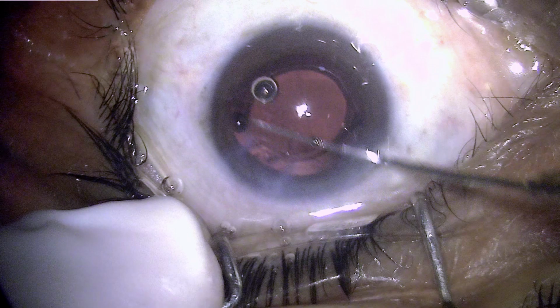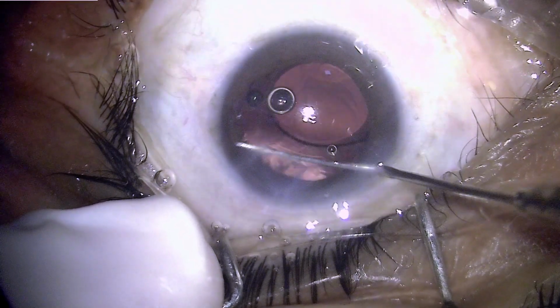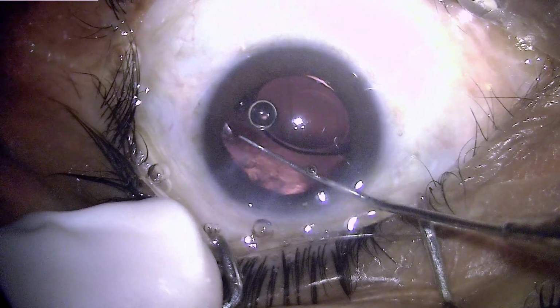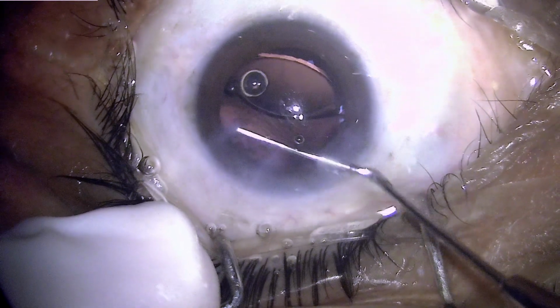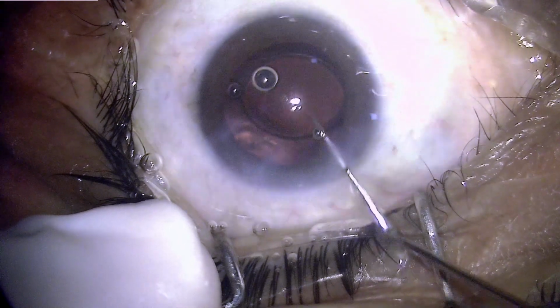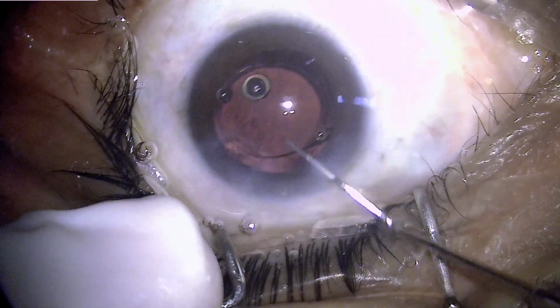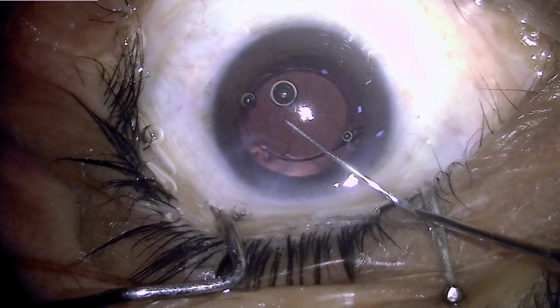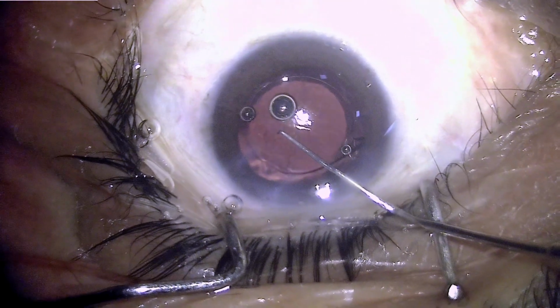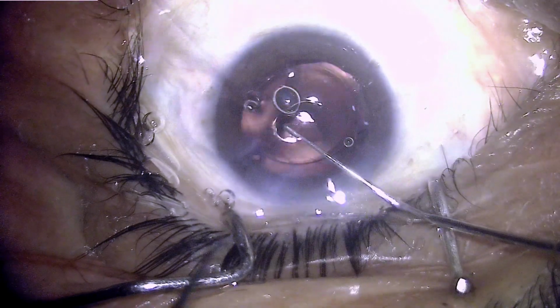So first of all, taking care to place the trailing haptic into the sulcus so that at least we have some anchorage of the IOL, and then reaching around to rotate this haptic which has twisted upside down, and this will need some more manipulation. I can see that one dialer itself cannot take care of the situation because the IOL must have been twisted and bent to the other side.